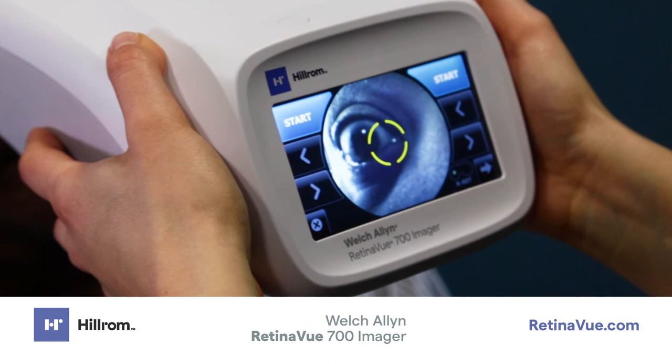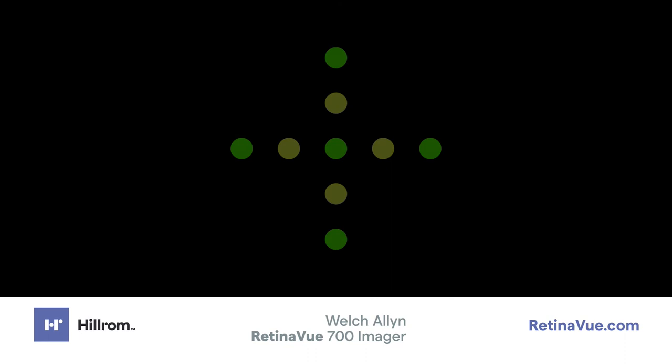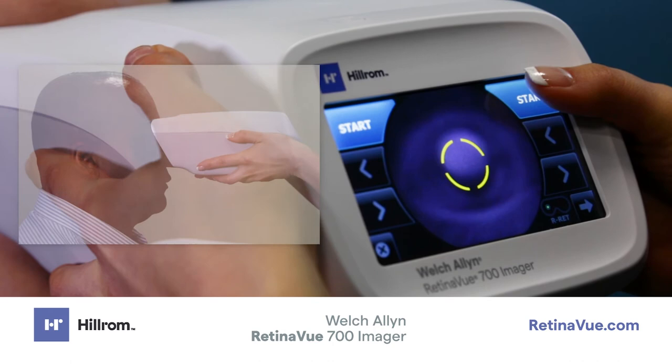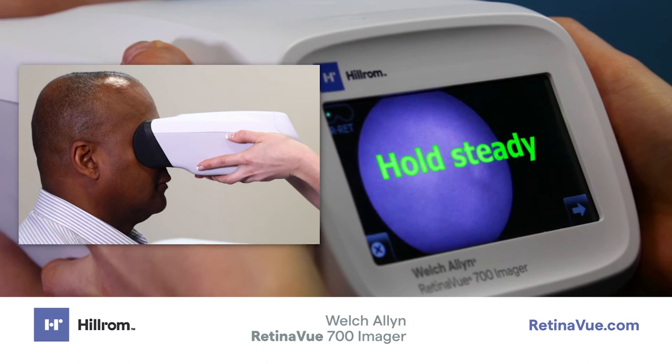The patient will see green and yellow dots in the shape of a plus sign. Confirm the patient can see the entire plus sign and tell the patient the plus sign will transition into a green dot. Ask the patient to follow the green dot. Use your thumb to touch start and hold the imager steady while keeping it pressed securely on the patient's face. Direct the patient to hold steady until the image is captured. Once the image is captured, the imager will automatically move to the left eye.